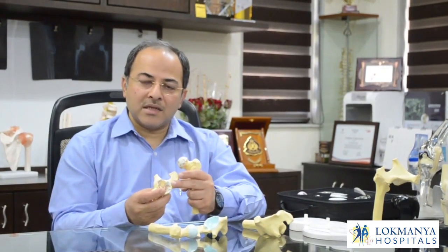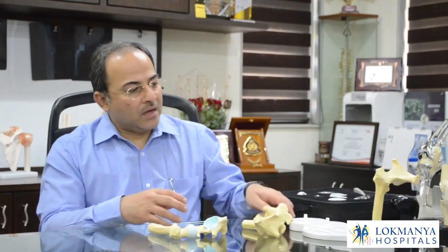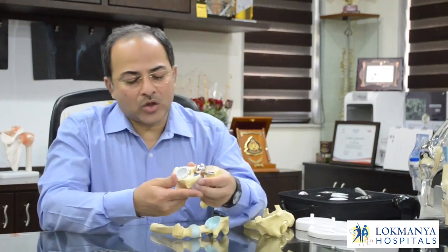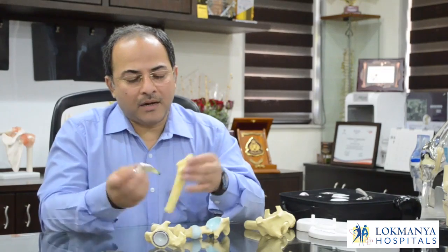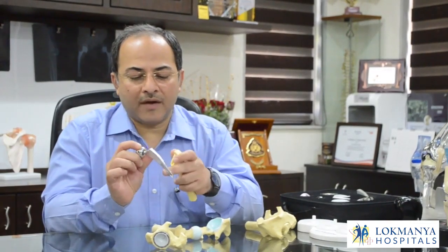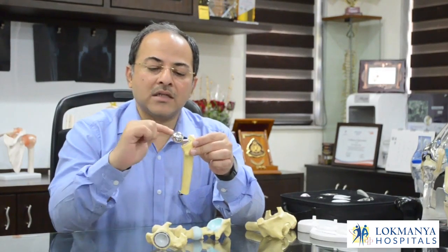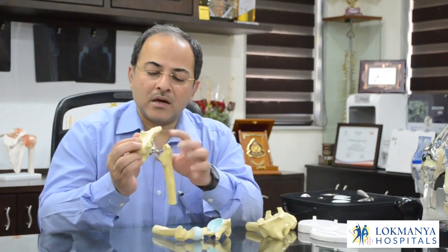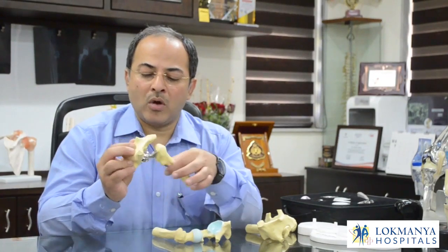In the replacement surgery we put a liner for the acetabulum to cover the arthritic joint with a smooth lining. The replaced hip joint looks something like this — you can see the socket lined with the liner. Inside the bone, a shaft or stem of the prosthesis is placed, then attached with a ball. The hip is then reduced to form a complete new hip joint for the patient that can move normally.